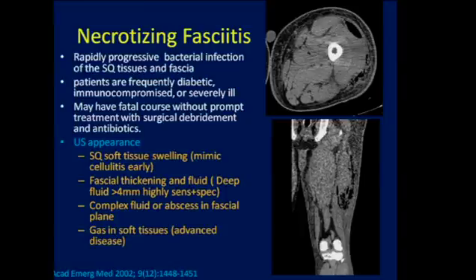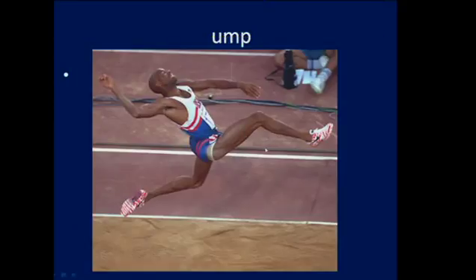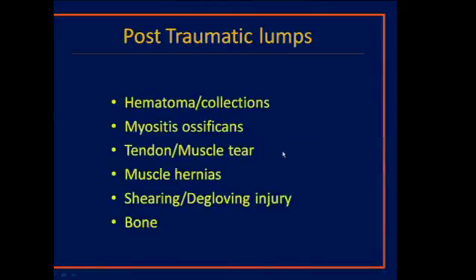Look for gas in the soft tissues, which we saw also in this patient, which was advanced disease. This is the same patient I just showed you. This is a CT scan obtained afterward. We see the stranding in the subcutaneous fat, but in addition, we can see thickening of the fascia and also gas along the fascial layers and even deeper. This is necrotizing fasciitis. Let's jump to the next category of post-traumatic lumps.